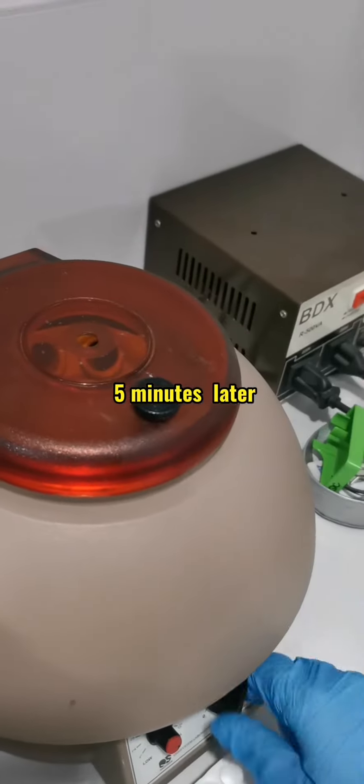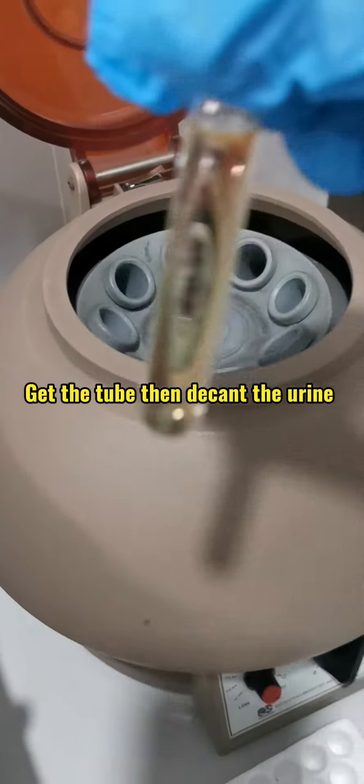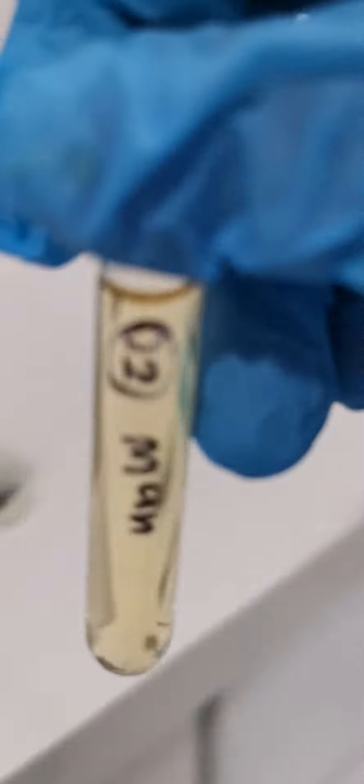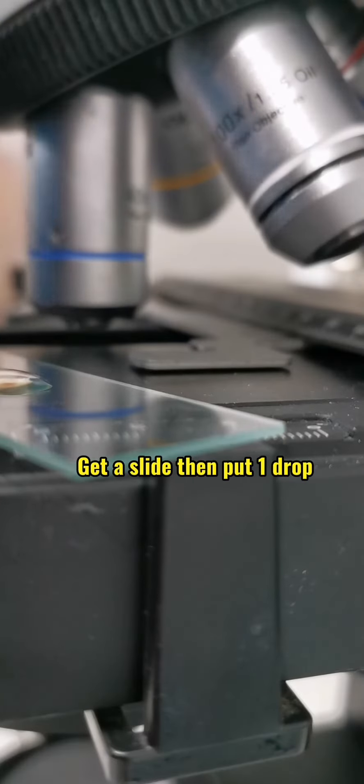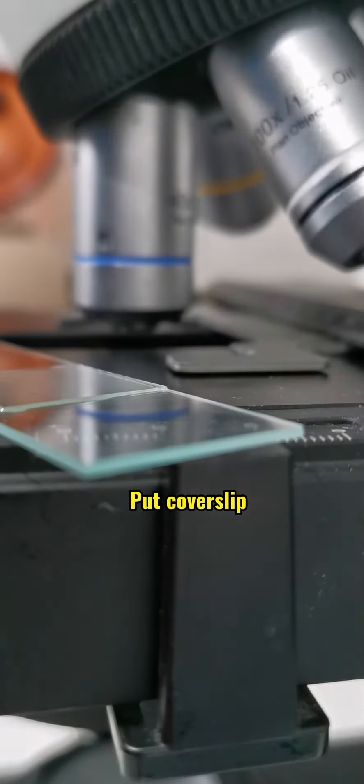Centrifuge for 5 minutes. Get the tube then decant the urine. Mix the sediment. Get a slide then put one drop. Put cover slip.